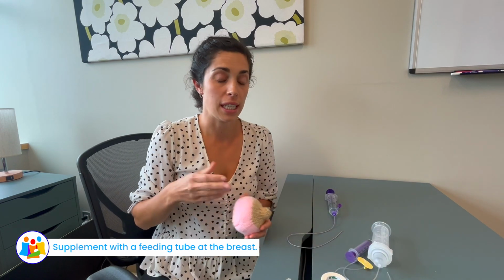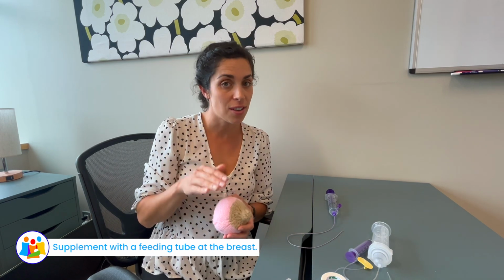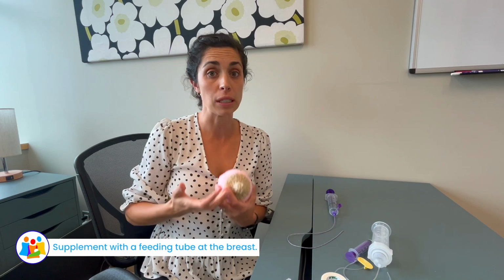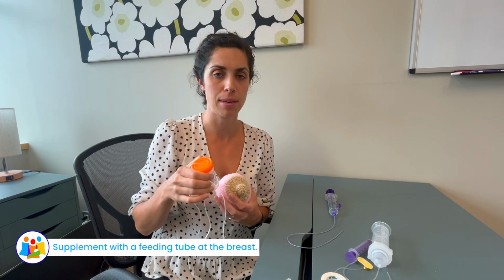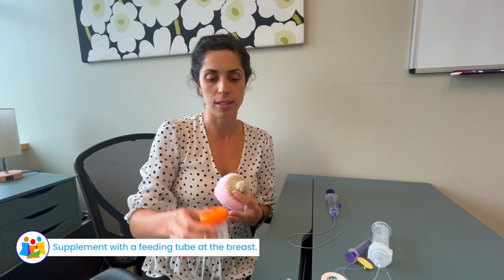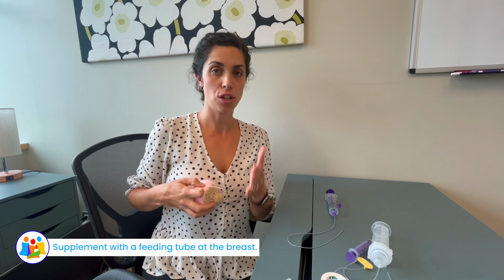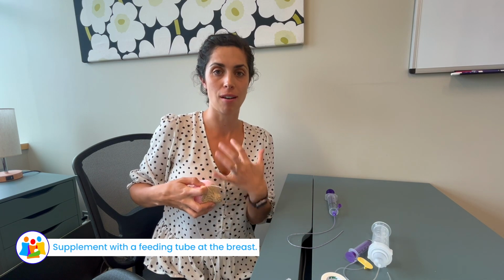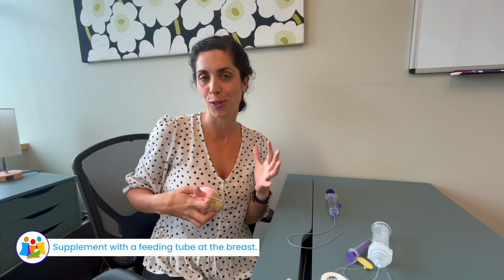Some people who only need this for some of their feeds will slide it in after they've seen the letdown happen and that drinking slow down, whereas for other people who really rely on this for most of the milk being supplied to the baby, will always insert it into the baby's mouth or have it ready to be latched onto from the beginning of the feed, so that the baby is associating very strongly with all of their milk being provided here, and this being a happy place where the milk flows.